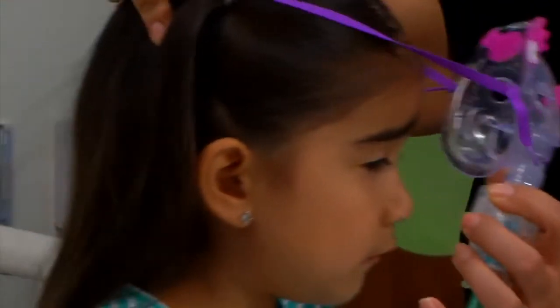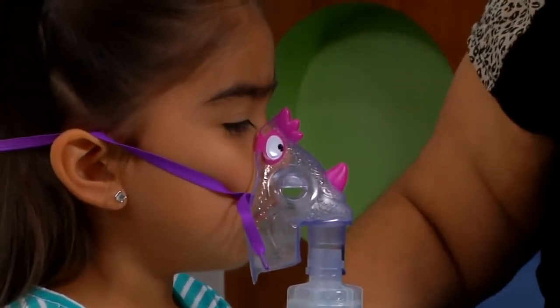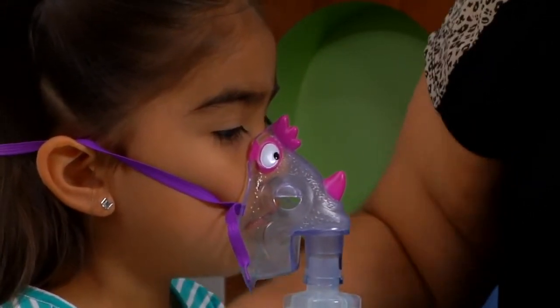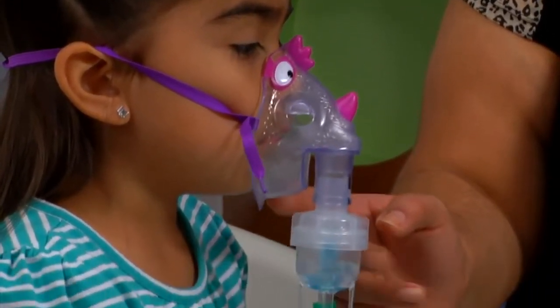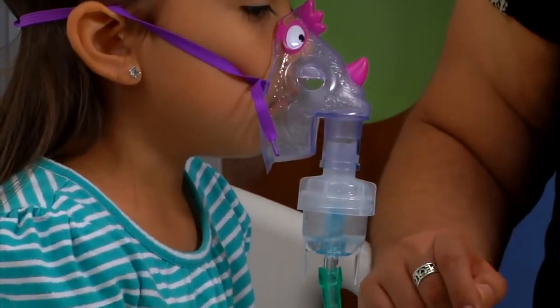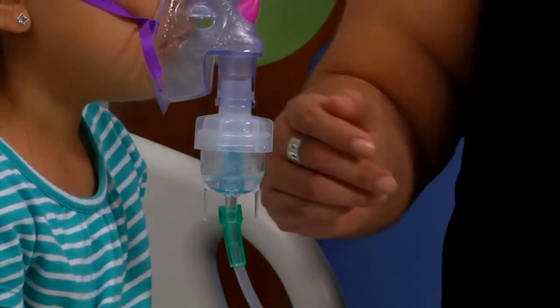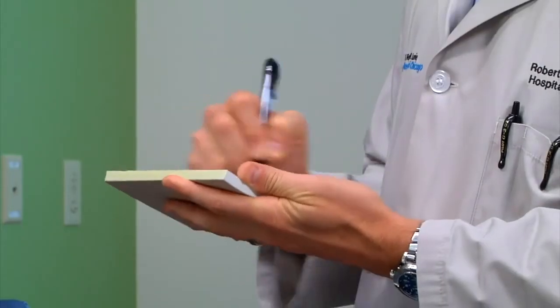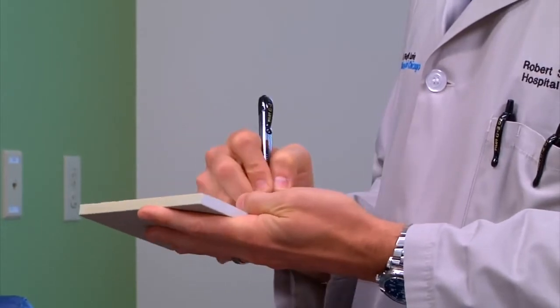So we allow the patient now to slowly breathe in the medication from the nebulizer or the machine. Slow breaths are recommended so that the inhalation will be proper and the medication will be taken in by the patient properly. We tap onto the sides of the cap to avoid the accumulation of the medication on the sides, so that the medication will be inhaled completely. So it is 7 to 10 minutes, and mixed medications may be done depending on the prescription of the doctor.